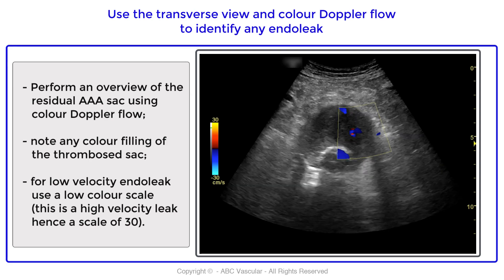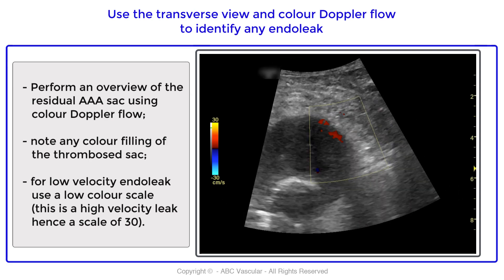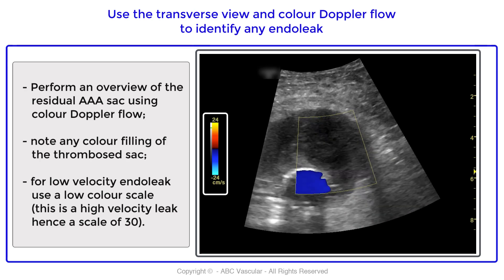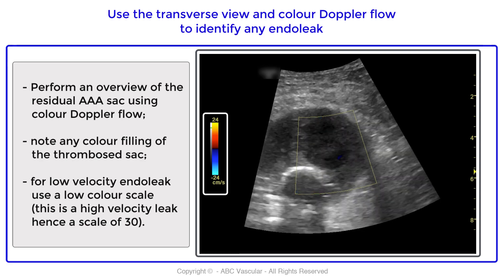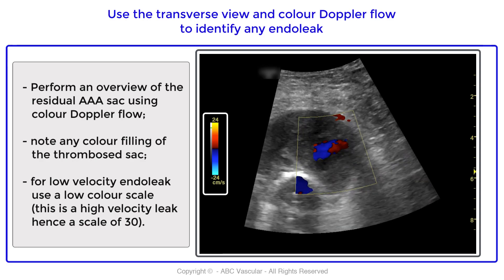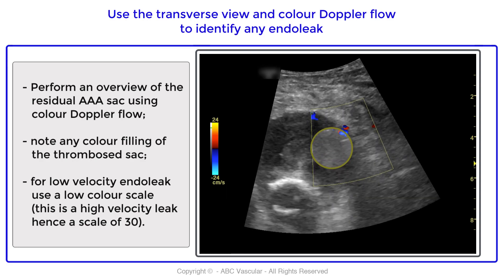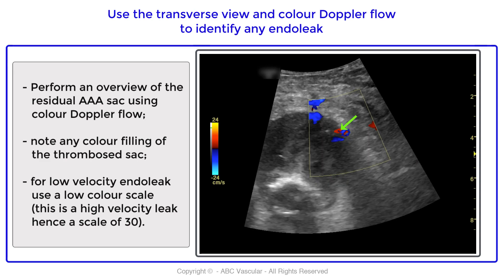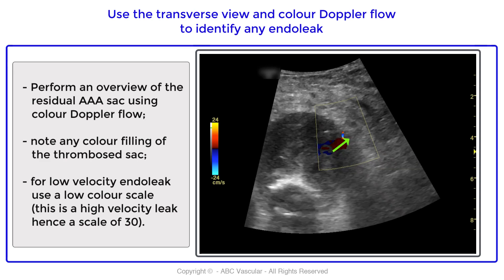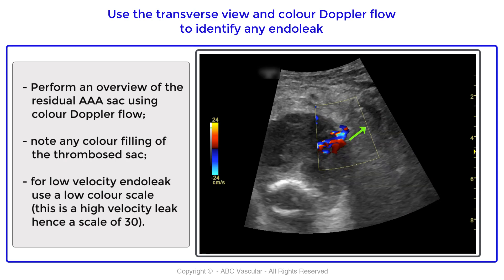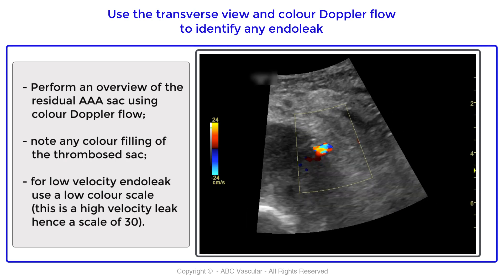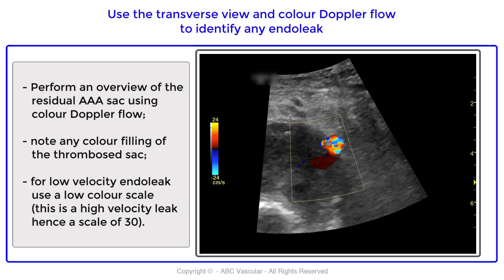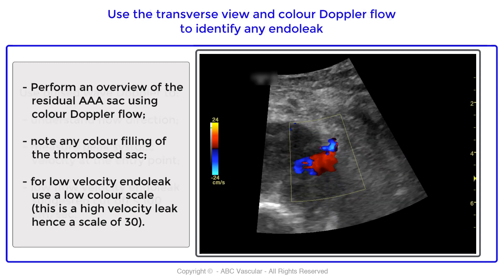This flow is pulsatile, observed with 4x zoom over the region of interest. Reducing the scale provides better definition of the color flow filling, and we can clearly see an entry point at the level of the lateral wall of the abdominal aortic aneurysm. This is therefore considered to be a type 2 endoleak, based on the level of entrance of the flow within the aneurysmal sac.